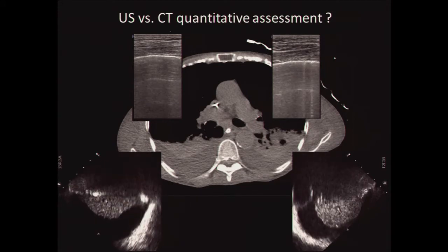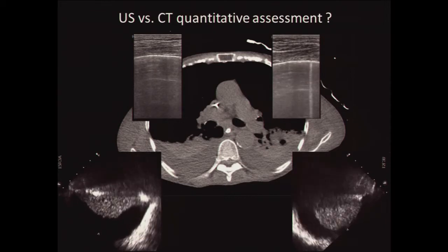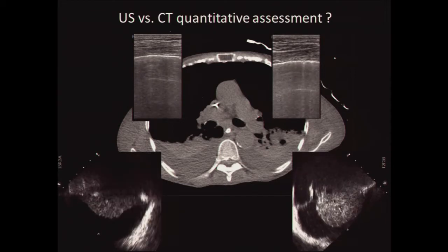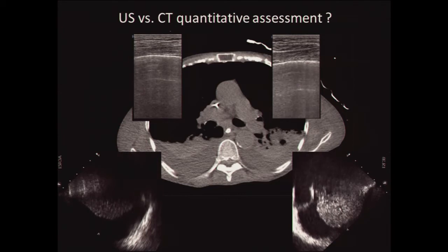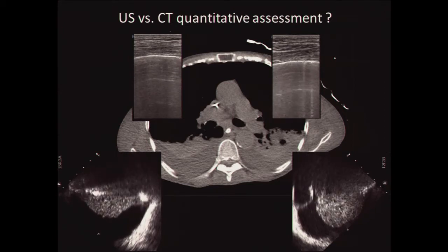So, is lung ultrasound just a beautiful image, or can we get from this technique quantitative information similar to CT?